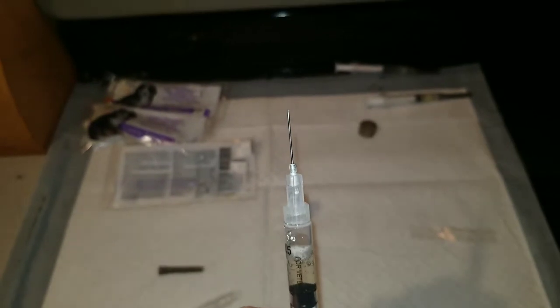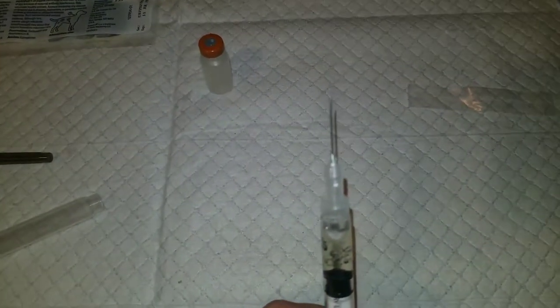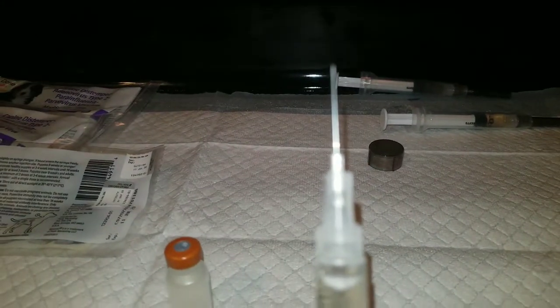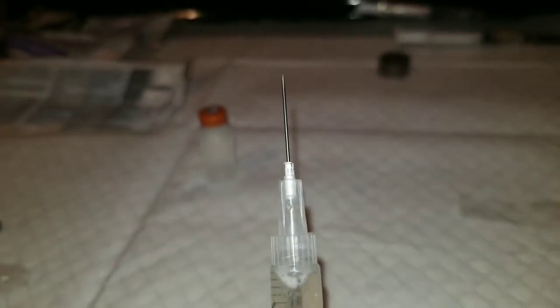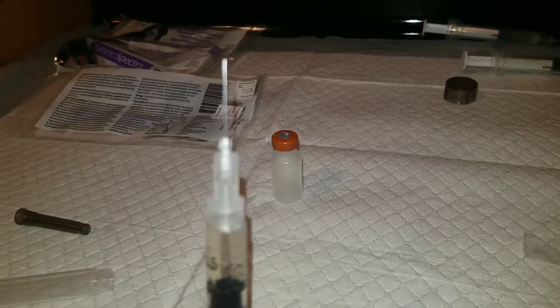You want to make sure that you push the liquid into the needle, making sure that there is no air. Make sure there are no big air bubbles — it's for the safety of the puppy.